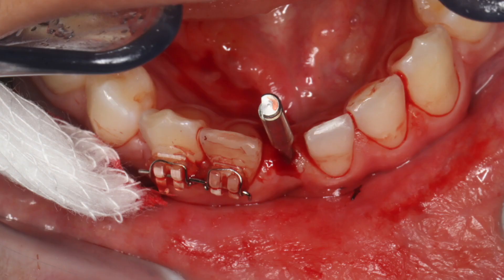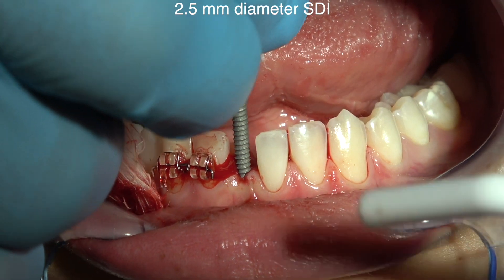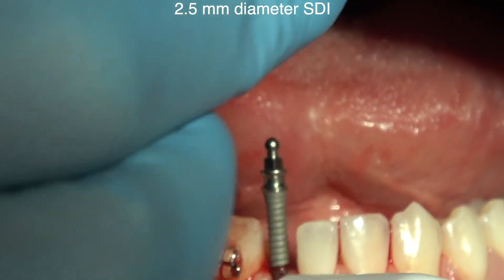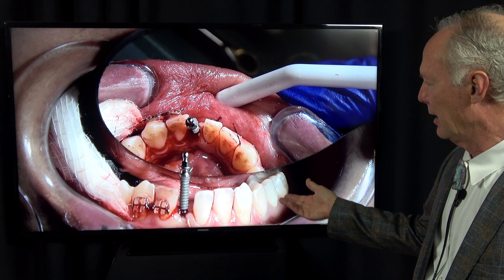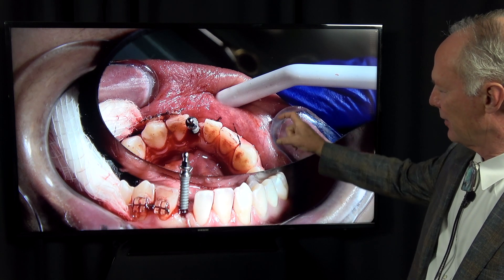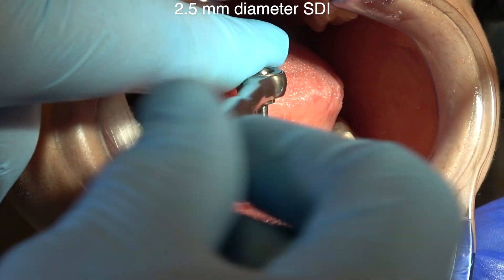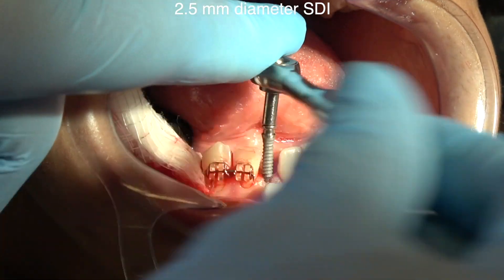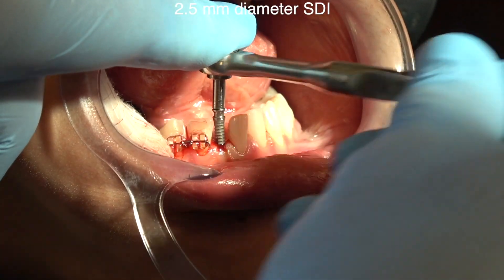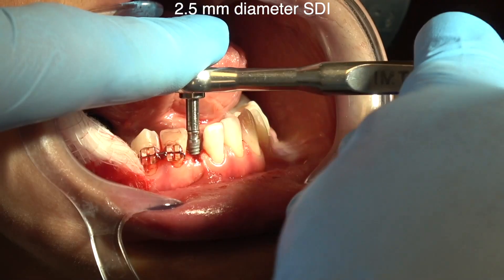Check your angulation. As you screw the implant in, you want to constantly check and be sure that it's in the right direction. You've got a choice of either a 2.0 or a 2.5 millimeter implant. I'd rather use a 2.5. If you use a 2.5, you've got to have a ridge that's what — 3.5, 4.5, almost a 5 millimeter ridge. So if you don't have 5 millimeters of alveolar crest facial-lingual, then you should go with a 2 millimeter small diameter implant. I believe this was a 2.5, but it's just so complicated because you're working with such a small amount of bone facial-lingually.